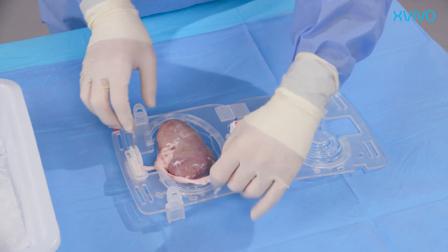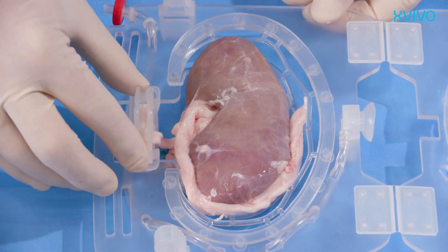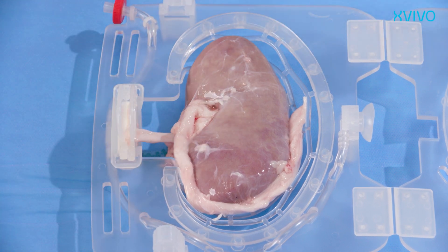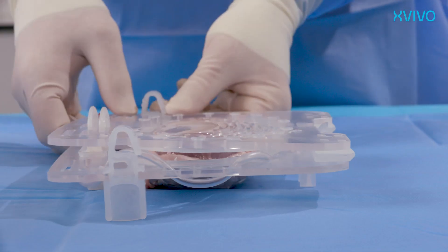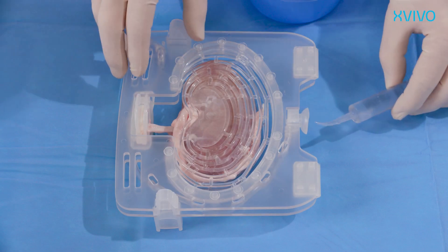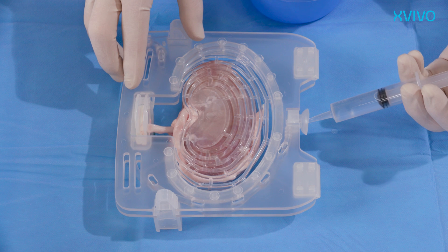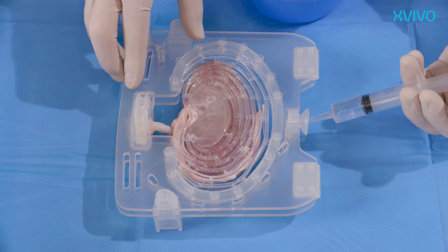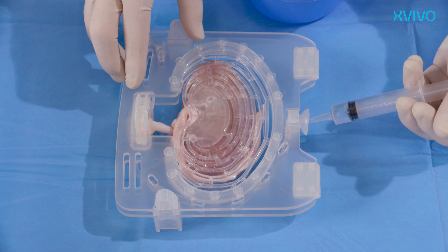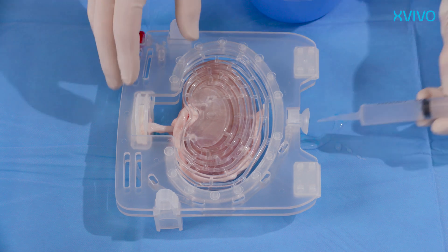Ensure the ureter is placed nicely around the kidney or outside of the kidney holder. The cassette can be moved up or down to adjust for the length of the artery. Close the kidney holder by folding the two parts together until the locks click. Check the connection of the kidney using the 10cc Monoject syringe. Aspirate some perfusion or preservation solution and inject into the cup at the bottom of the kidney holder. Repeat 2 or 3 times and ensure that the connection with the patch is leakage-free. In case of any leaks, try to resolve these before placing the kidney in the perfusion reservoir.